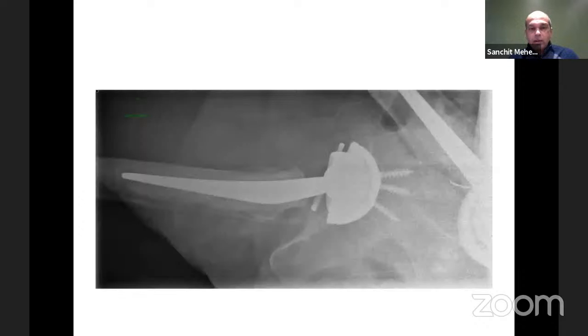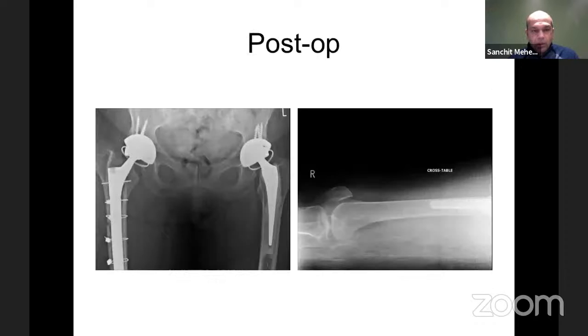Okay, this was the lateral, and the lateral looks fairly innocuous on that view. Our go-to stem is a long uncemented stem in these situations. If the patient can tolerate an operation that's long enough, and again, you can see that we've cleared most of the cement. There is still a thin sliver of cement around the lesser trochanter, but by and large you've restored the tube and then go back to a constrained mechanism. We did not have to do anything to the cup because that was well fixed.